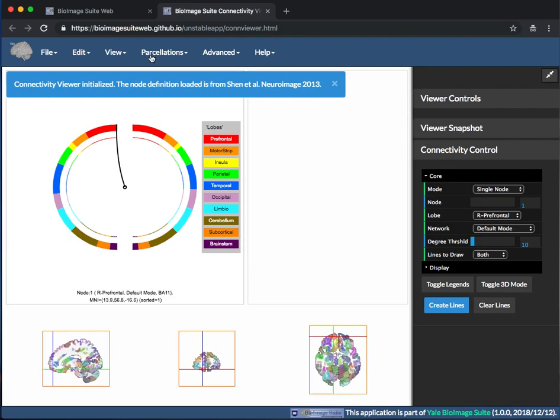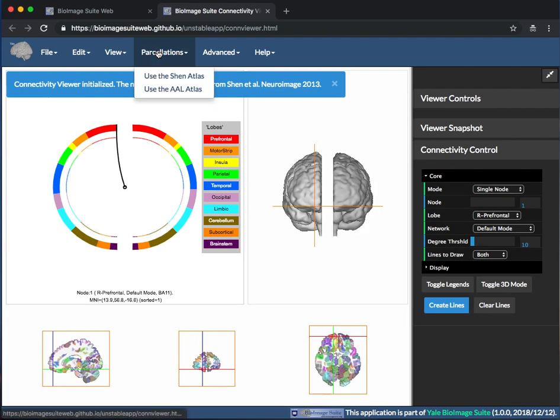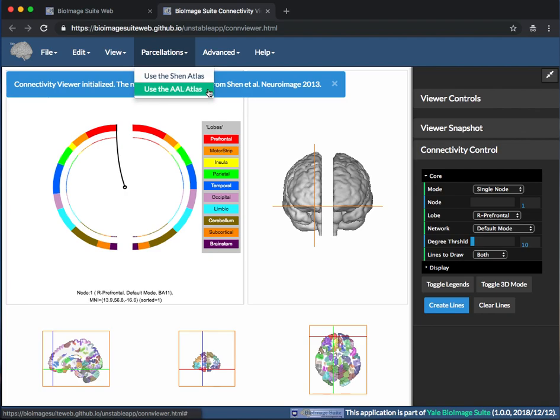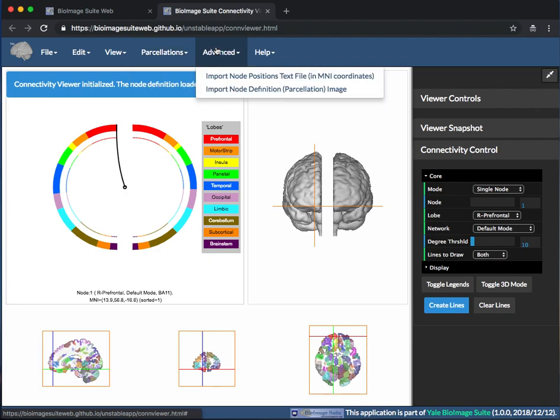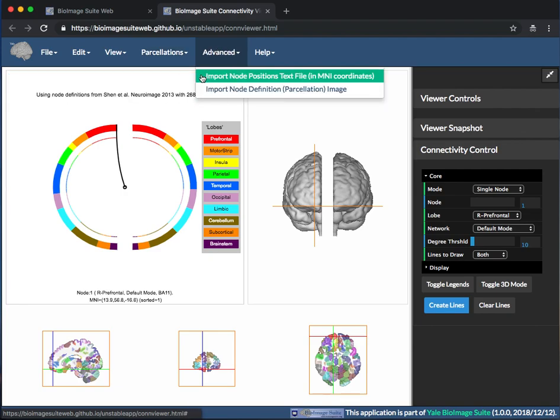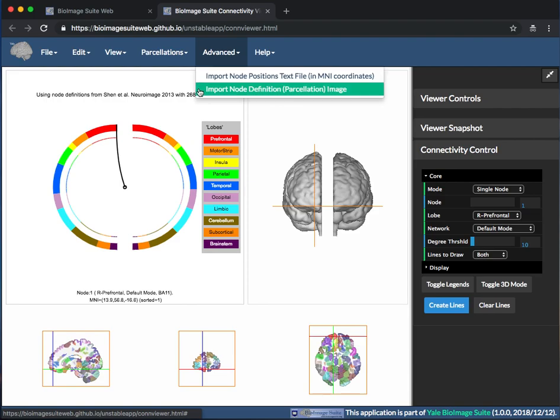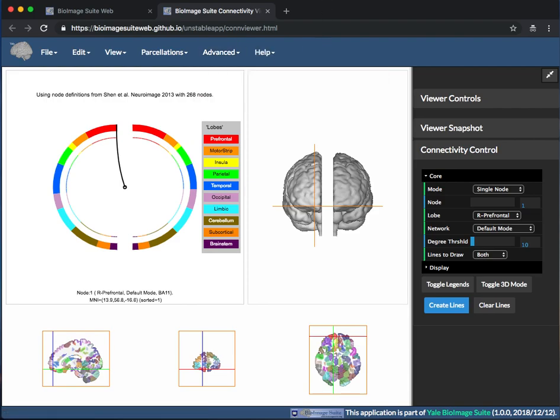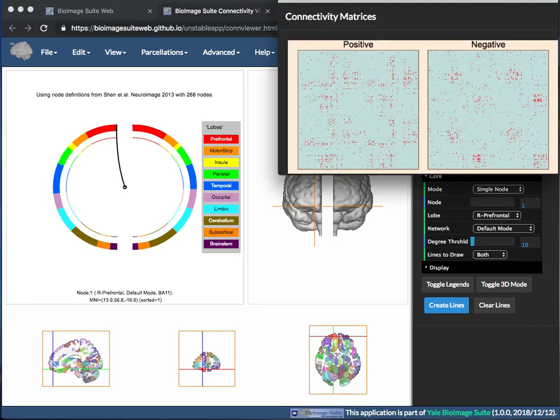The Connectivity Viewer has built-in support for regions defined within the Shen or AAL atlases. You can also import your own atlas either as an image or as a list of node coordinates. The first step is to create a matrix where each entry represents the relationship between a pair of regions.